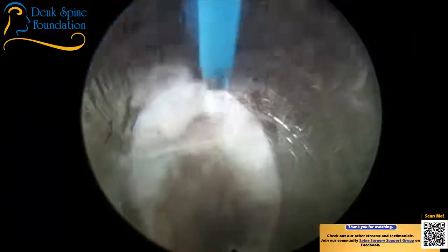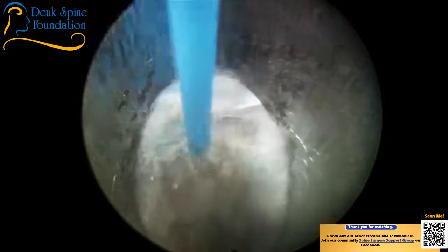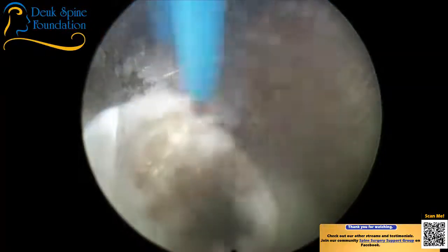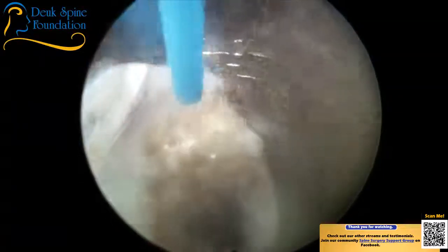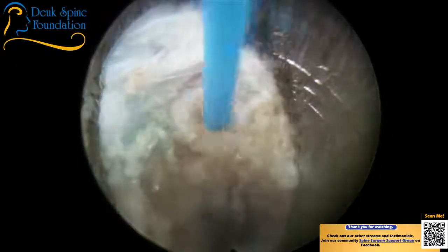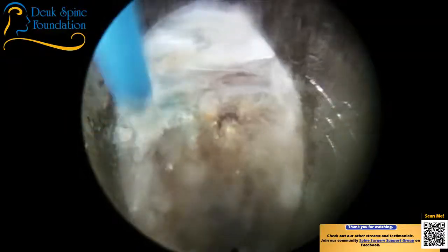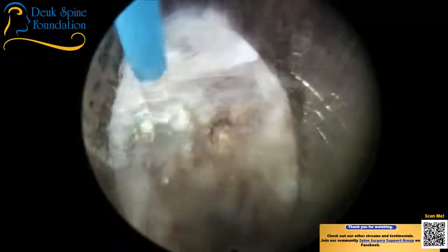But this is the end of the disc herniation right here. This is the last bit. So this is the last part of the tear. Once again, you can see the body's tried to heal it. It's just been unsuccessful at doing that. And as a result, she's had ongoing pain in her back.